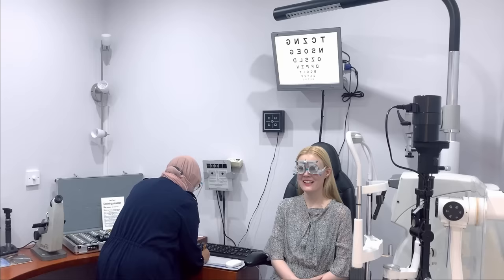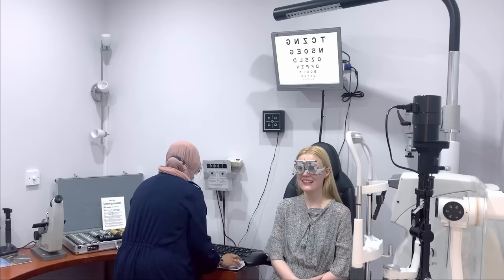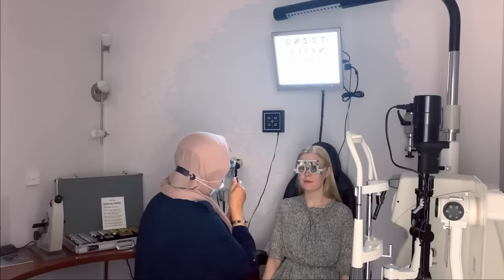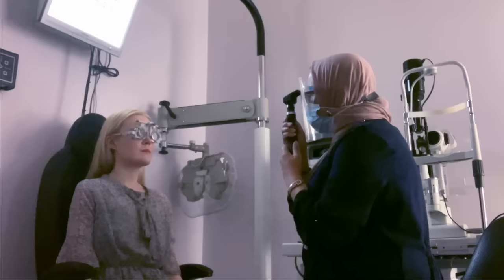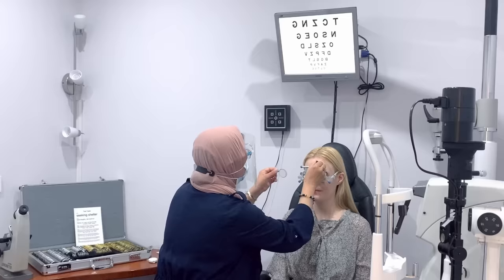So what I'm going to do now is make you very blurred, okay? Okay. So if you look straight ahead for me, I'm literally just going to shine some lights in your eye, okay? All right, I want you to just look straight ahead for me, okay? I'm going to have to turn the lights down for a bit, okay? Don't look at my light at all. Keep looking straight. This just helps me confirm that what I've got for you is correct, so that's good.